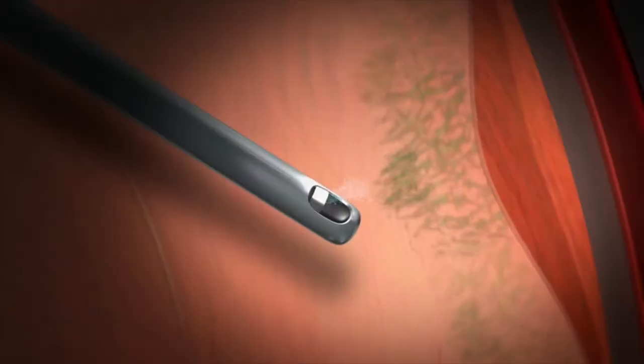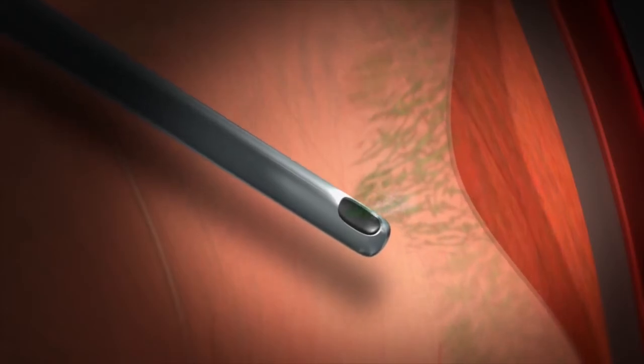The last thing I will criticize is this system where the knife coming down does not close the port. It is a blade cutting on both sides, narrow enough to clear behind it an aspiration space when it reaches the end of its stroke.